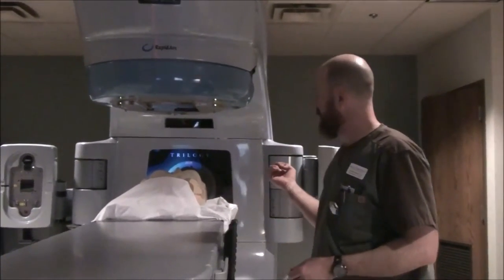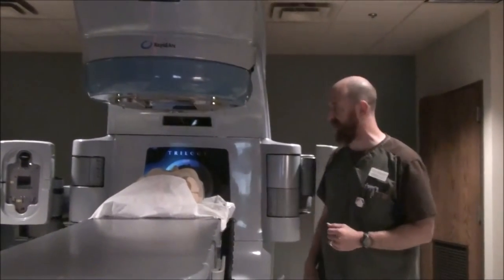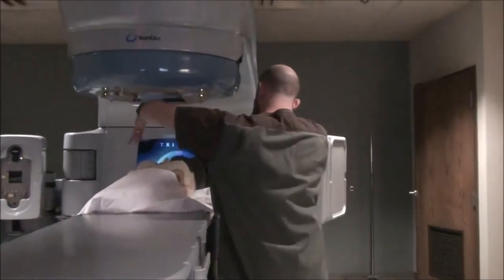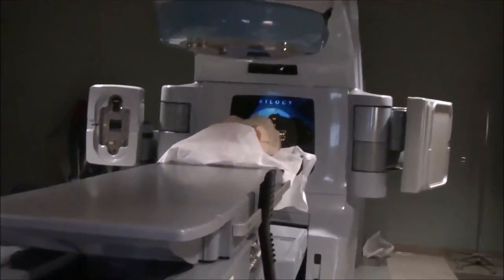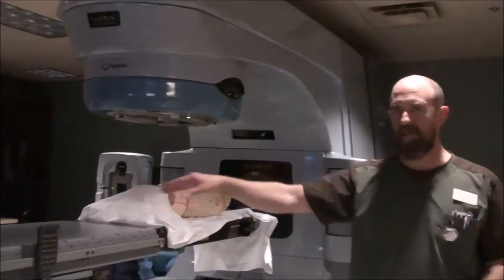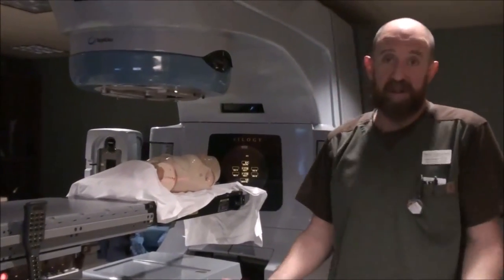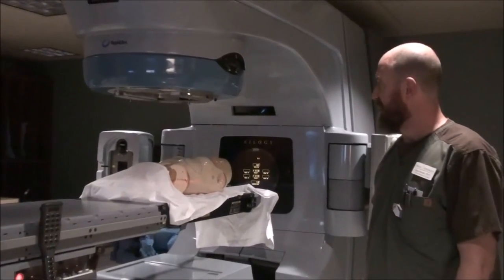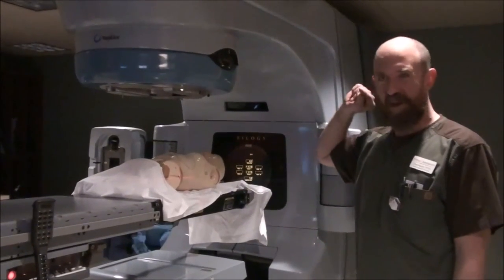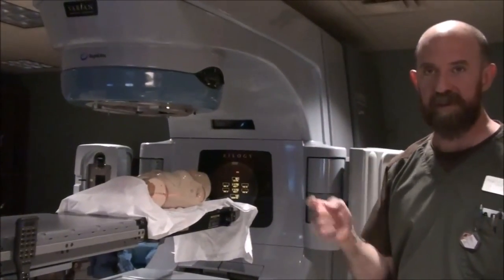You've got four films, and you will then extract any tubes and contrast materials from inside the patient. Take your photos — a lateral picture, an anterior picture, and a full body picture. Make sure it's not just a sheet over the patient — that looks like a morgue picture. You want to be able to see what you did with the feet, how the pelvis looks, where the hands are, and what the headrest looks like, just in case you forgot to write something down. That's the ins and outs of a supine simulation. In just a moment we'll move into a prone position and go over prone pelvis simulation.